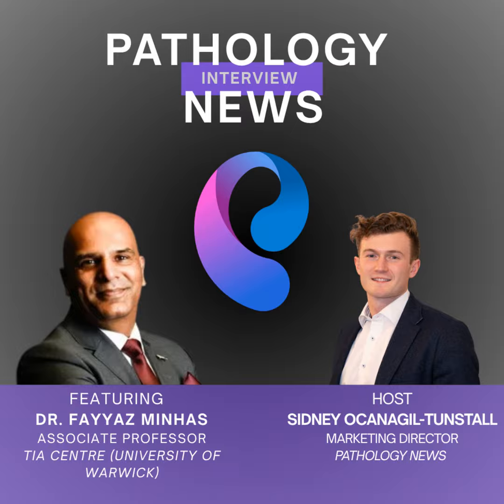Yeah. So a lot of these machine learning methods that are coming out are trying to predict the mutation status of different genes. For example, BRAF, or they can predict the mutation status of TP53 or another gene for that matter, right? What we asked ourselves is, is the only effect that these models are predicting that one particular mutation or not? So when we say that a model, using a whole slide image as input, is predicting whether a patient is BRAF mutant or not, is it really only that mutation that it is picking up?